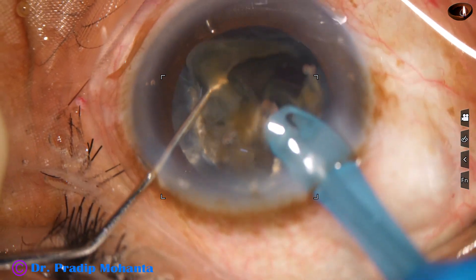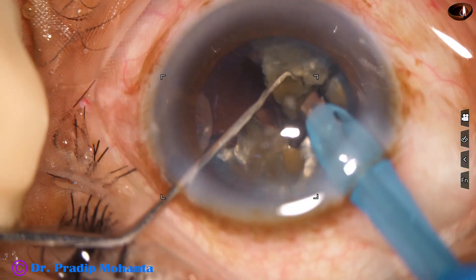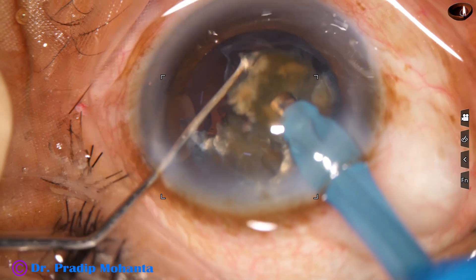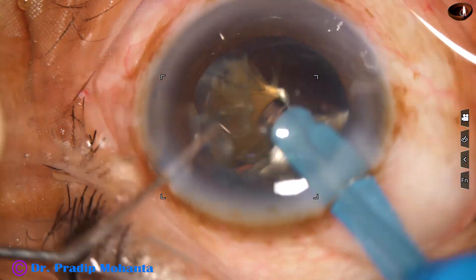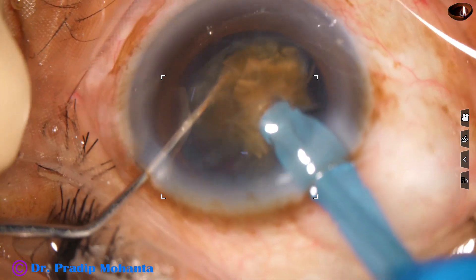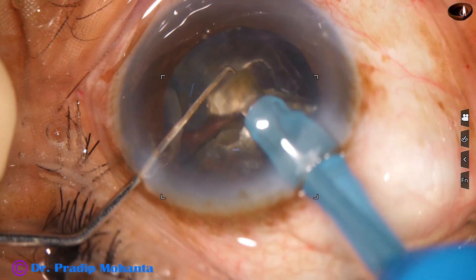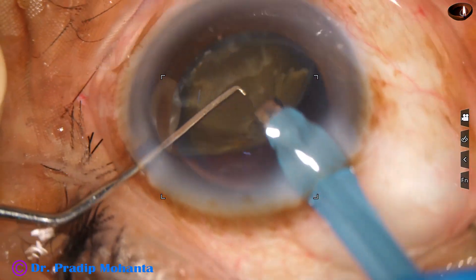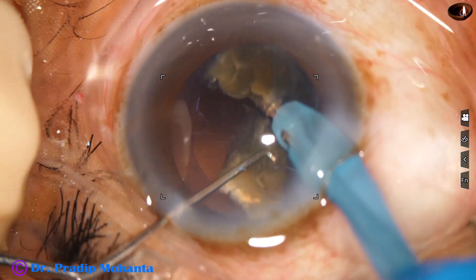Ultrasonic energy is 85% in this case and flow rate is 45 ml per minute. The nuclear fragments are being emulsified. I start emulsifying the fragments from their apex. These are very hard nuclei, and the sharp apex, if it goes towards the posterior capsule, will cause a lot of pressure at a point and may sometimes pierce the posterior capsule. So always start emulsifying the pieces from the apex.